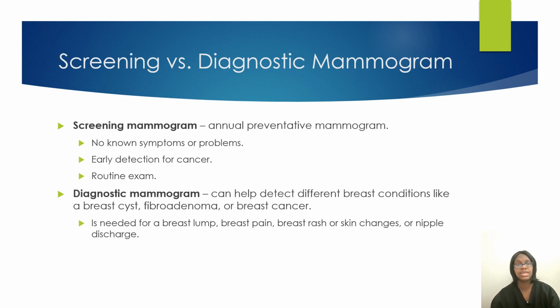For screening versus diagnostic mammogram, I talked about this more in depth in my first lesson, patient care. If you haven't checked out that video, go check that out. But your screening mammogram is your annual preventative mammogram. The patient should not have any lump, any concerns.